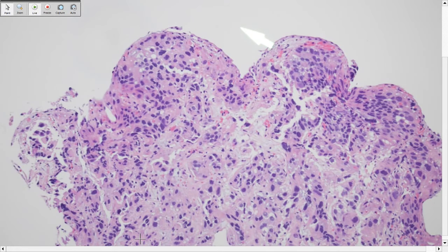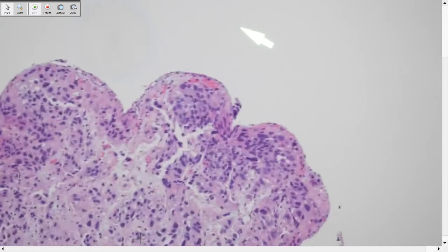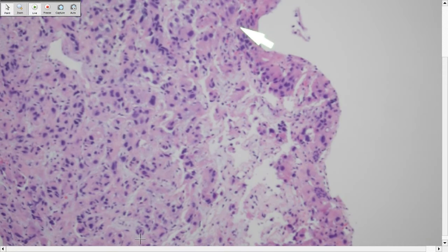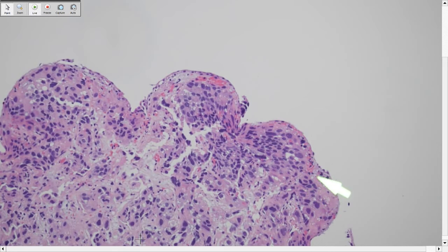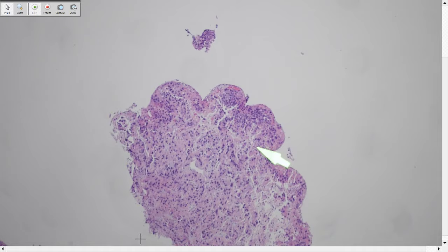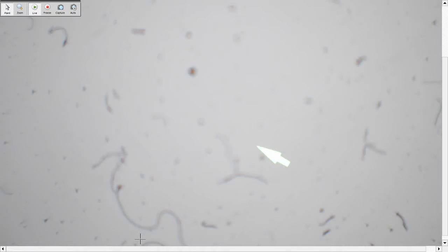Yeah, that's why it very much confused me, because this looks more like urothelial carcinoma, right? But it does not form glands. So if you do not know the patient history, or the patient never had a biopsy, you may think it's just urothelial carcinoma, and you may not even consider immunostains. Yeah, it's not very bad. I think what sometimes clinicians don't understand is that we go through these dilemmas. If the prostate cancer has already gone to the bladder, you don't want the patient to have something additional done.